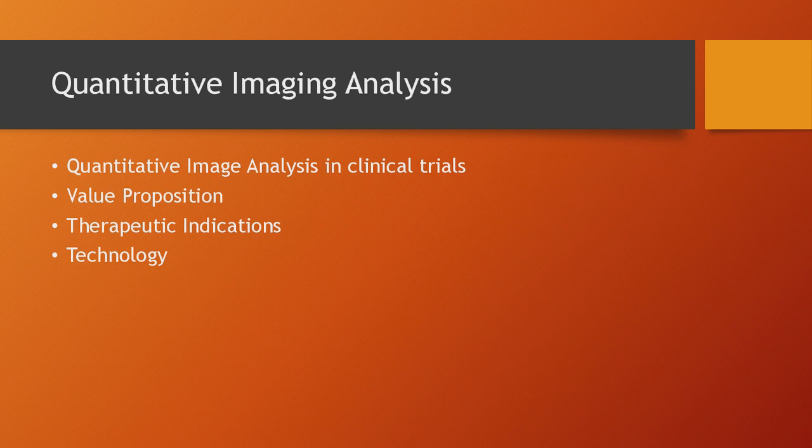Because even if we are in a clinical trial of cancer, obtaining images from chest, abdomen, and pelvis, and looking for lesions or metastases, we have a lot of information that is hidden to the naked eye and that should be quantified.